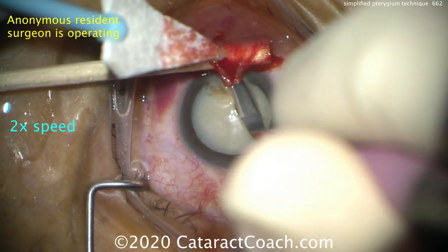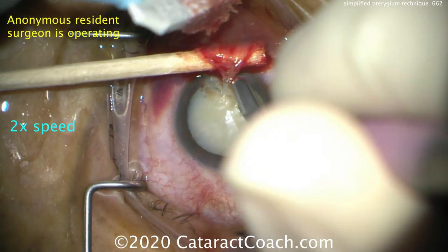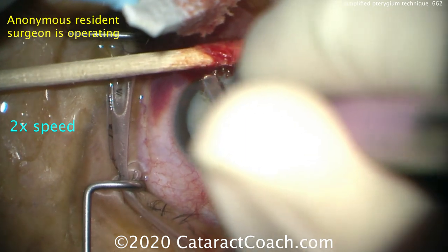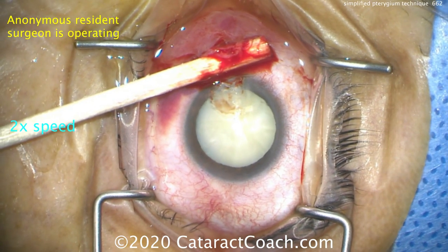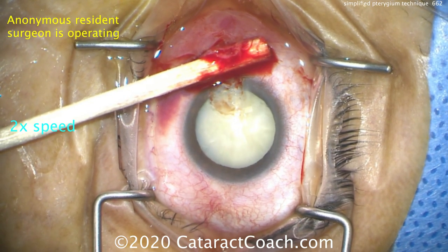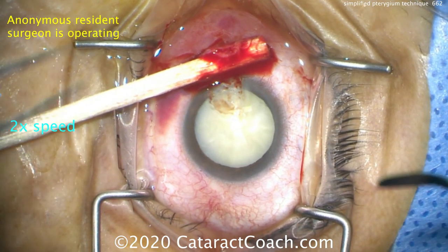We've sped up the video a little bit here, and we have an anonymous resident operating. So if this resident can do a beautiful job here, I promise you can too. Now it's been taken off the cornea — that looks pretty good. We can smooth out and clean up that cornea as well.